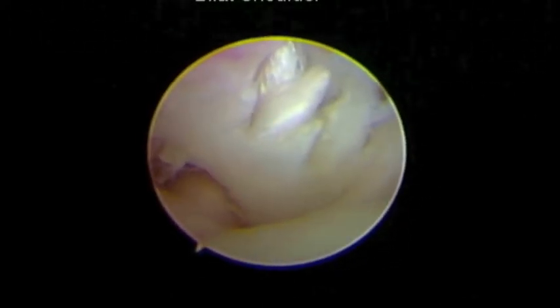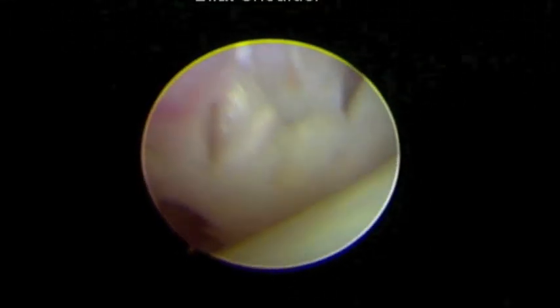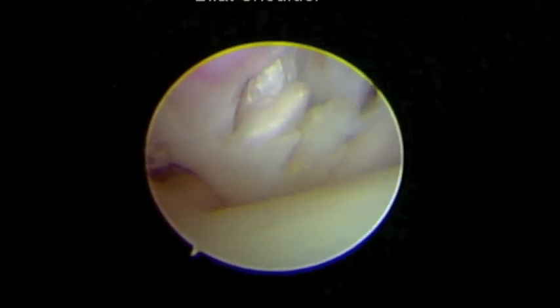Working our way back anteriorly, there's our biceps again — just completely ripped off the bone, so it's not functional. It's like getting your hair pulled every time you take a step, just pulling on the nerve endings and the little bit of tissue that's still attached. Completely non-functional shoulder.